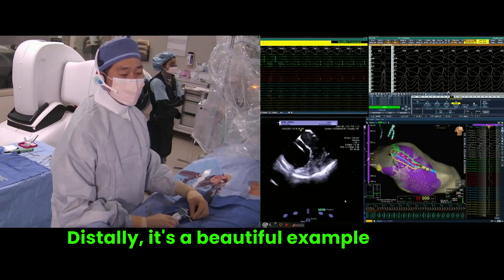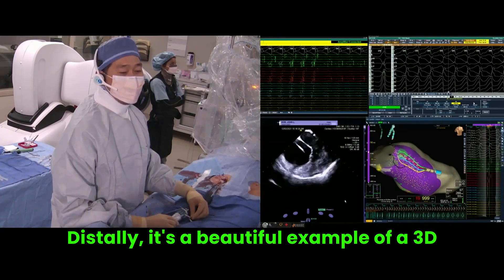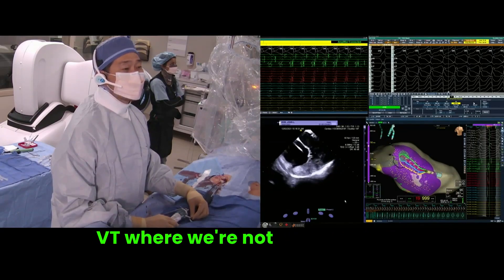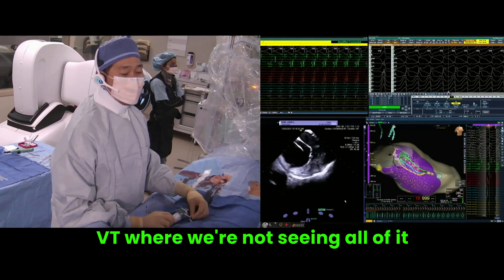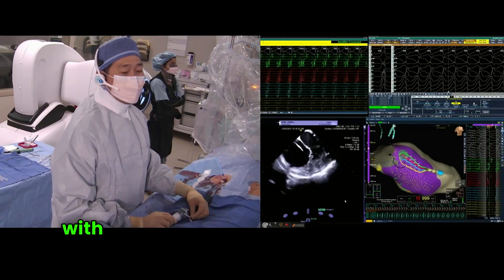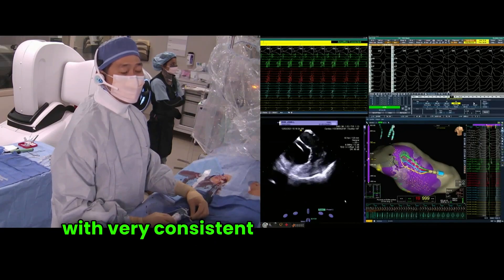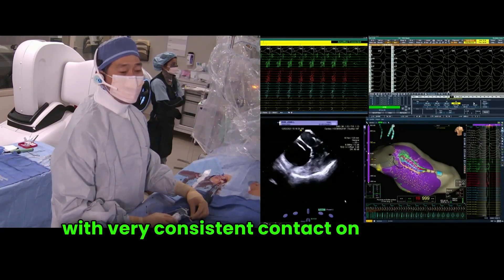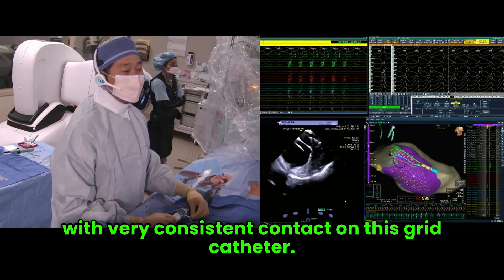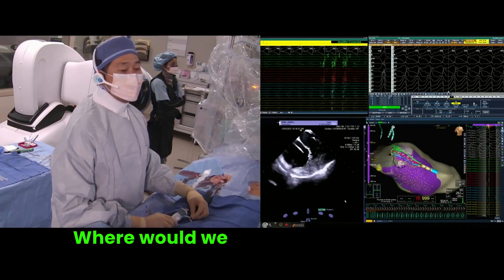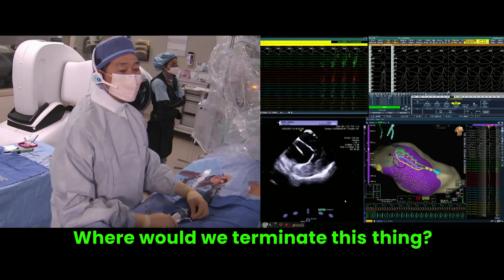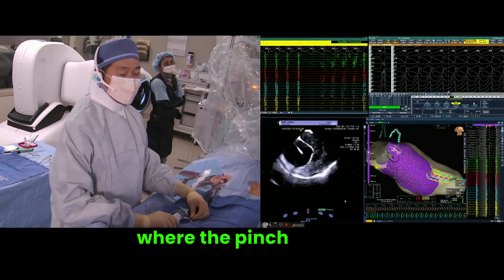It's a beautiful example of a 3D VT where we're not seeing all of it, with very consistent contact on this grid catheter. Where would we terminate this thing? Well, we'd probably terminate it at where the pinch point is.